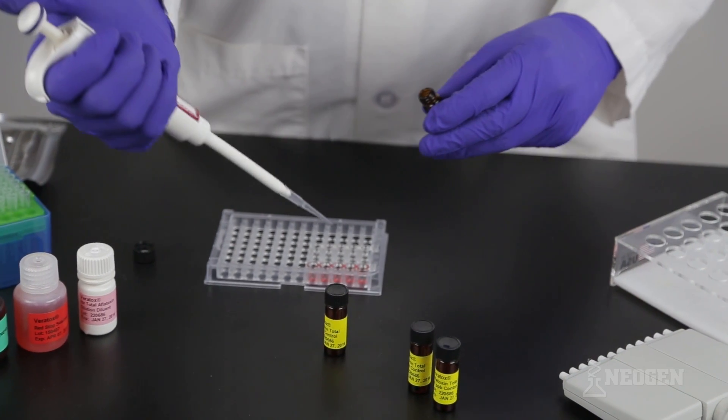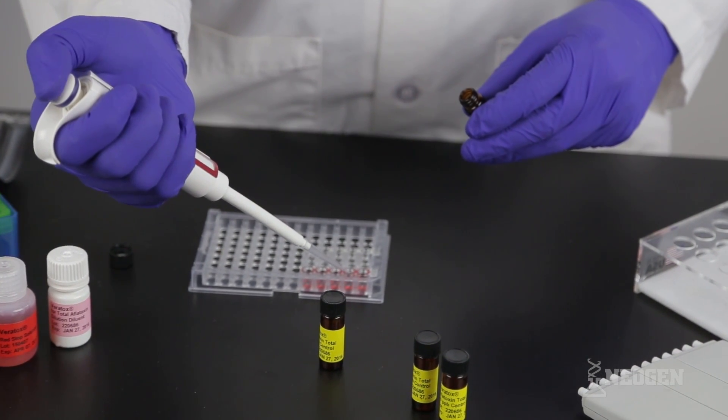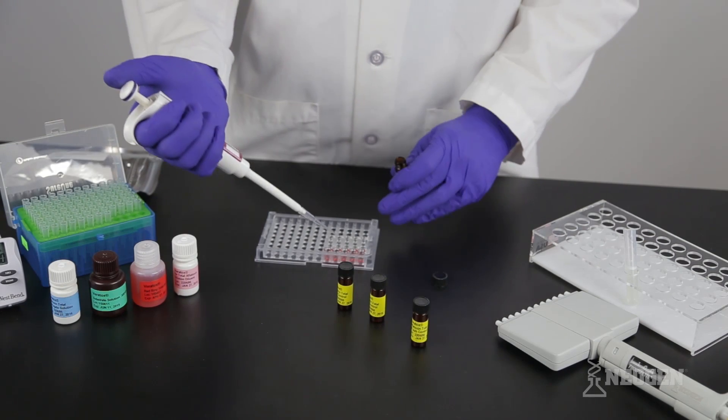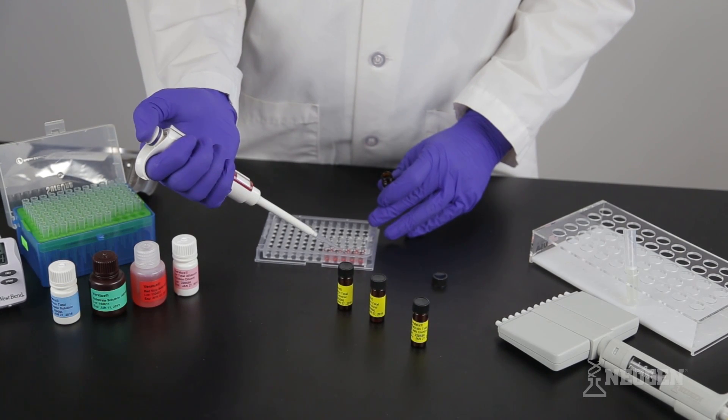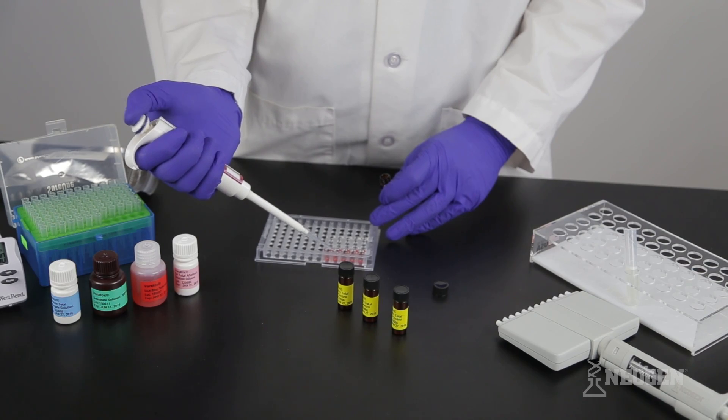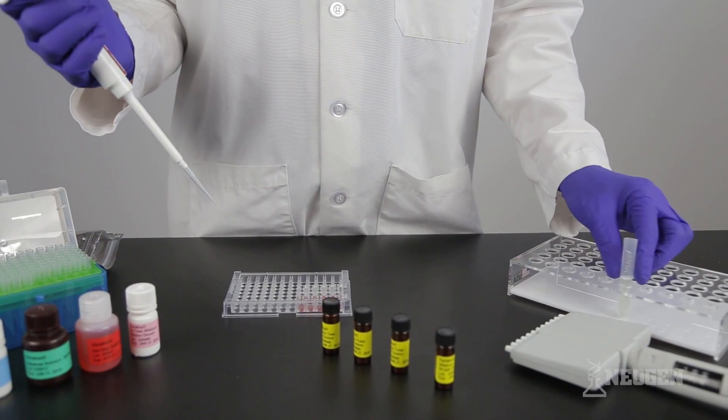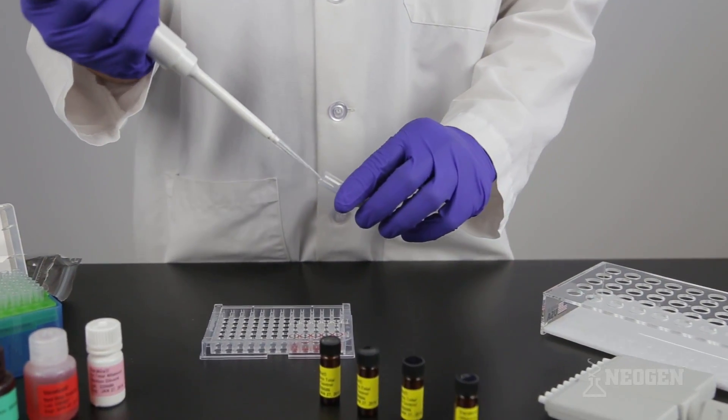Using a new tip each time, place 100 microliters of the 5, 15, and 50 ppb controls into the appropriate wells. Then, add 100 microliters of sample filtrate into the appropriate wells.